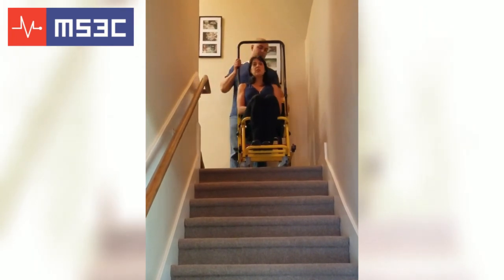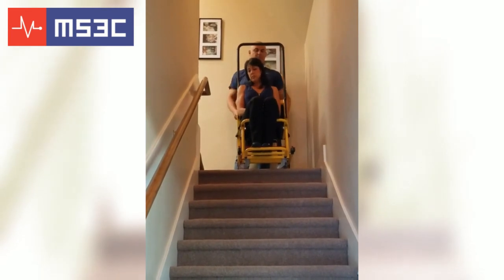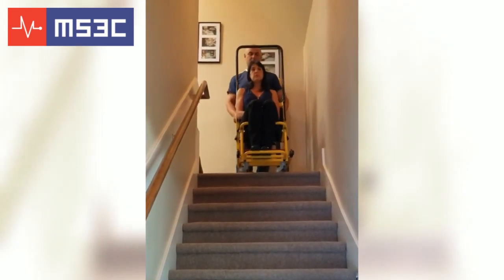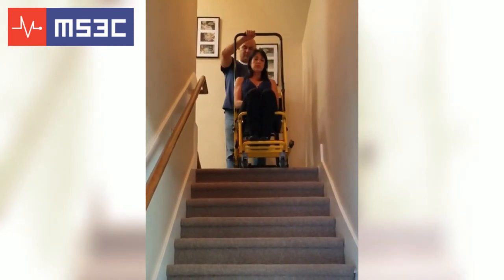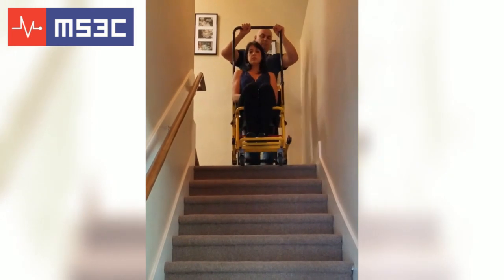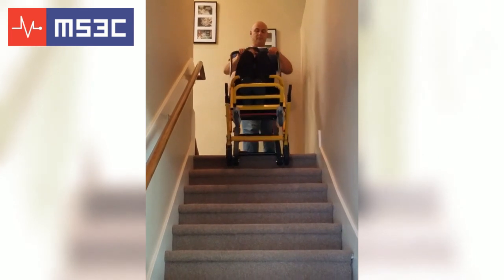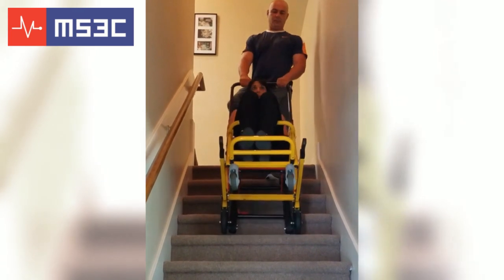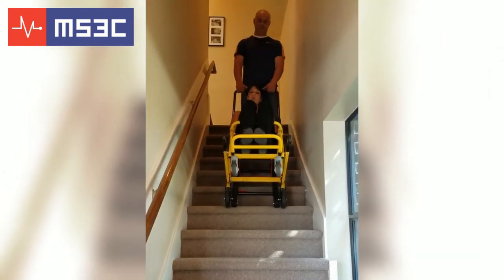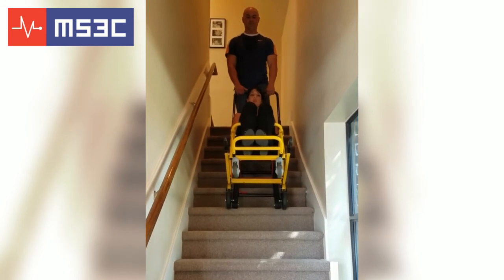Once seated, align the chair with the staircase. Slowly lower the chair directly onto the track and guide the chair over the edge. Continue down the staircase at a slow, controlled pace. Once you reach the bottom of the staircase, tilt the chair back up to its upright position, making sure the front wheels are securely on the ground. Assist your passenger out of the chair once you've reached a safe location.